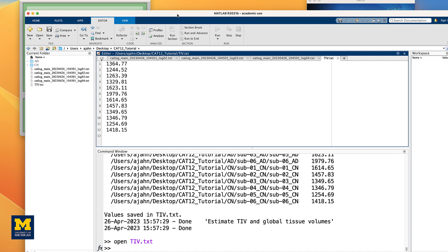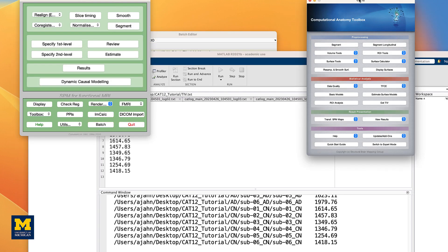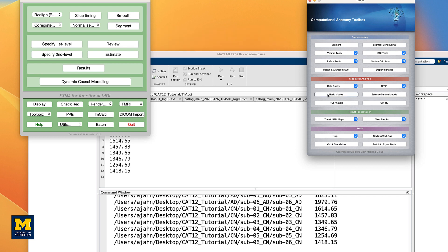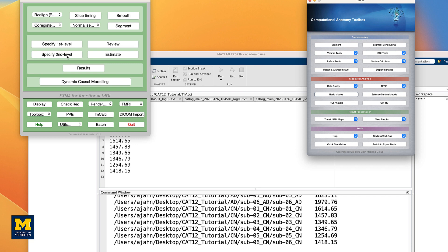You have two options for setting up a group-level analysis. You can either click on the button Basic Models in the CAT12 GUI, or you can click on Specify Second Level in the SPM GUI. Both are basically the same. The only difference is that the CAT12 GUI uses a factorial design as the default. These can be modified to do the same thing as a two-sample t-test in the SPM GUI, for example. You just have to specify the appropriate factors and levels. For this tutorial, we will use CAT12's Basic Models button.